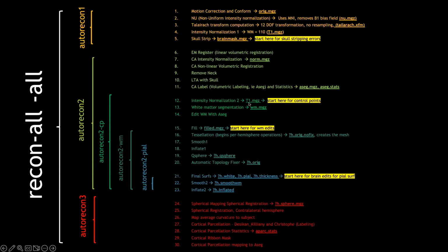And also, we're going to be talking about this later, but when you're doing corrections and when you're correcting the output, you need to stand on these different images to modify the actual output. So we're going to be talking about that in a bit, but keep in mind that you need these images, and the order of these processing steps is important for the corrections.